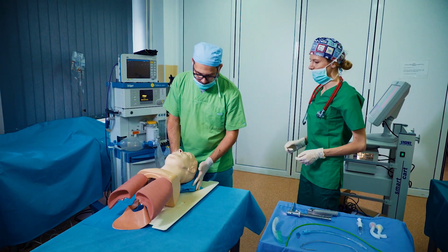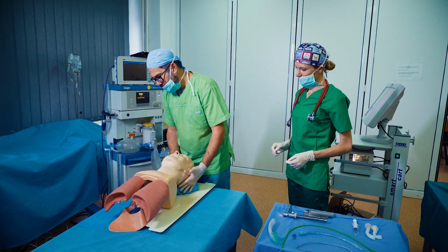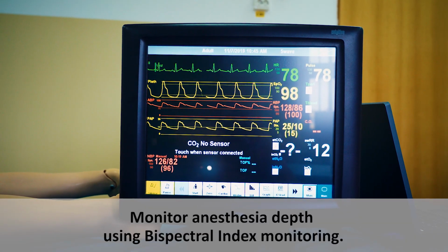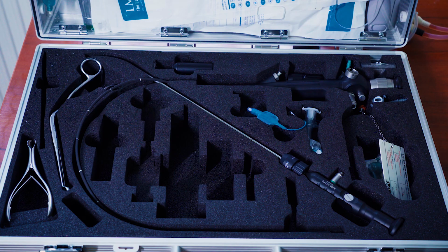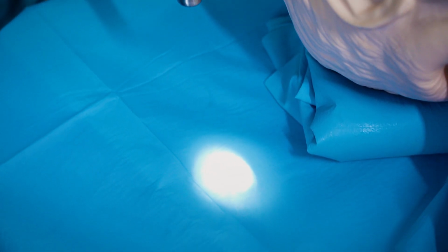The patient lies on the operating table with the head placed on tilt in a sniffing position. Apply standard hemodynamic and respiratory monitoring. Make sure that help from an experienced anesthetist or ENT physician is available in case of an emergency. Prepare a difficult airway kit at disposal and assemble and check the rigid tube with light source attached.